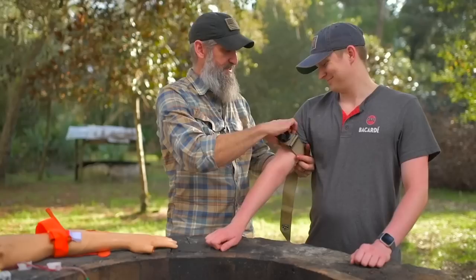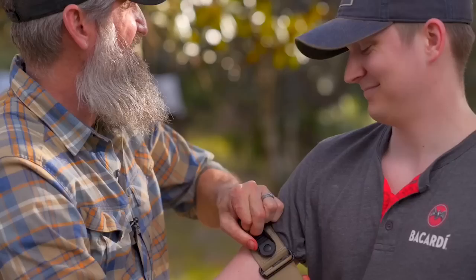When placing this tourniquet on somebody — even yourself — it's going to be extremely painful. You're crushing tissue and constricting blood flow. I'm going to use the RevMedx TX2 because it's very easy to operate mechanically, and I'll be able to check his pulse since he doesn't have an actual active bleed. When this pulse stops is when I'll stop cranking. I'm going to place this on, put it up nice and high, and get it as tight as possible before I start cranking.